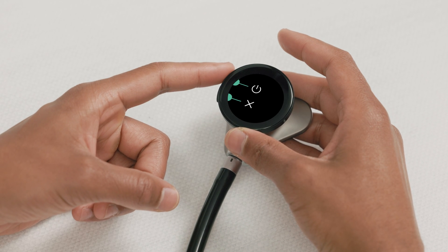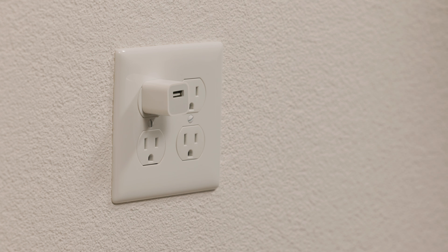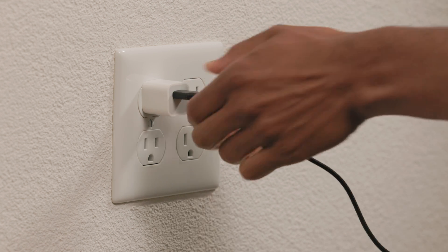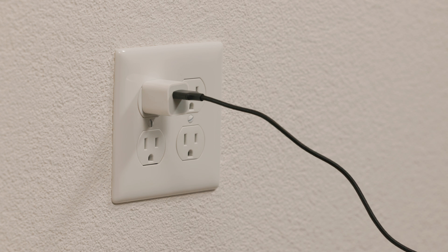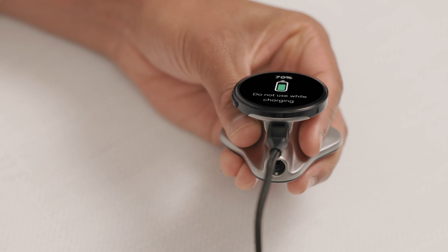When you see the confirmation screen, press the volume up button again. To charge the device, connect it to a power source using the included USB-C cable and a power adapter. The device can't be used while it's charging or if it loses battery power.